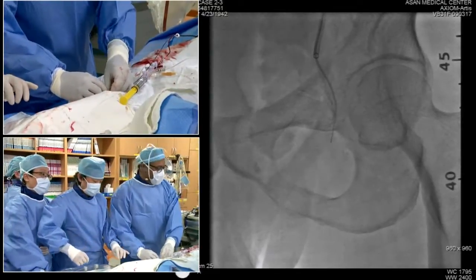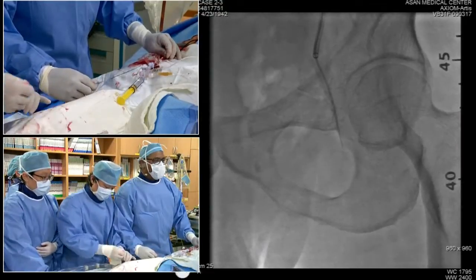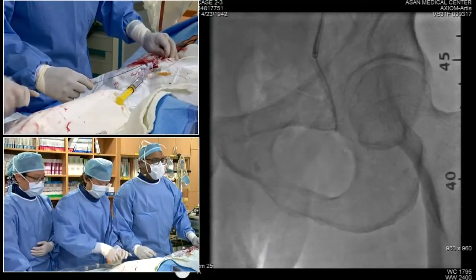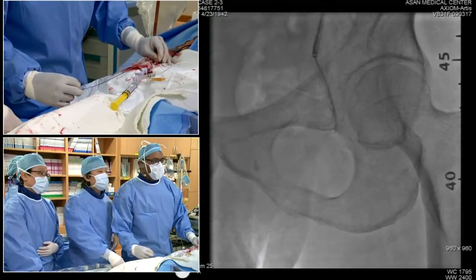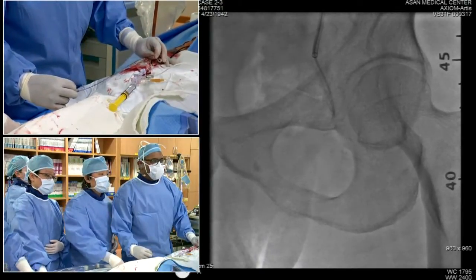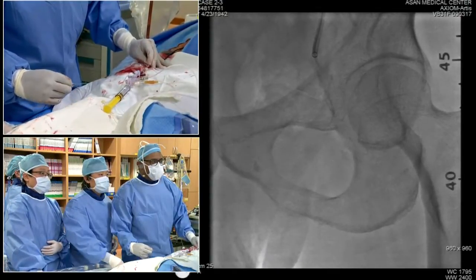I think the main advantage of going retrograde, though, is that you end up in the same plane as the stent. So even if you're subintimal when you come proximal to the stent, you can pop back in and have a chance of success. The problem from coming from above is that if you get subintimal coming from above, you may not be in the same plane.